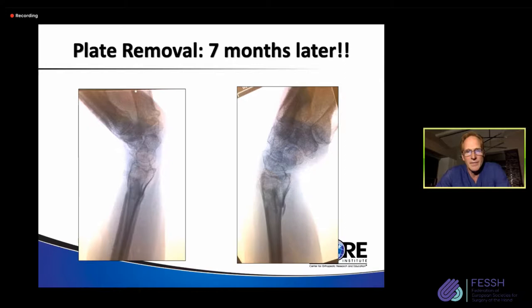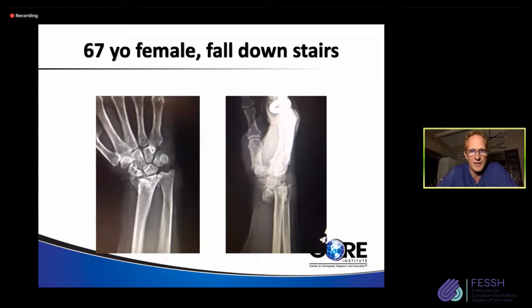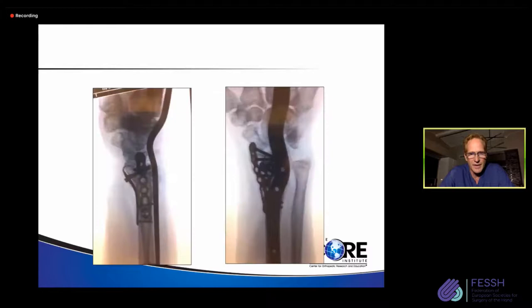Here's a 67-year-old female, fell down the stairs. Again, a very far distal fracture showing this is very soft bone. And I think most of the attention would be on the lunate facet, at least in my mind. And so we spanned it to the third metacarpal, but also used quite a bit of fragment specific fixation to get those pieces back where we wanted them.